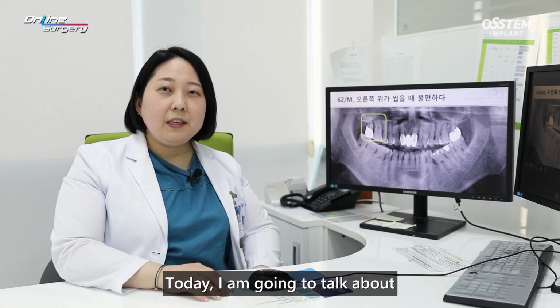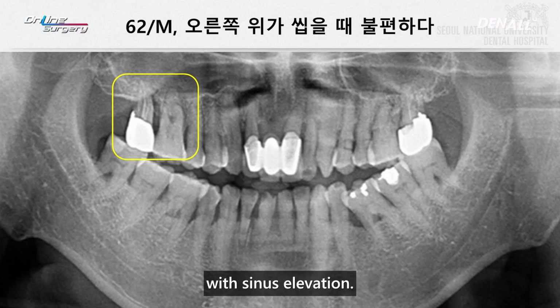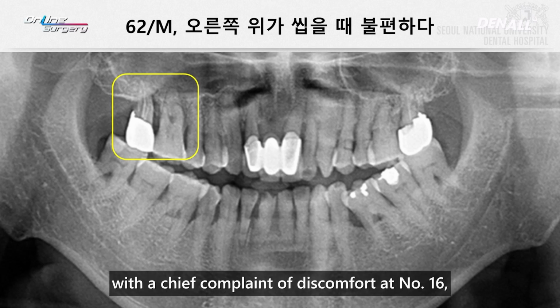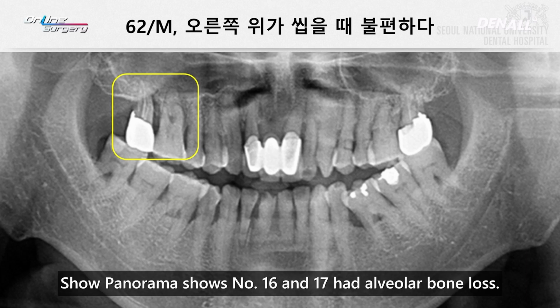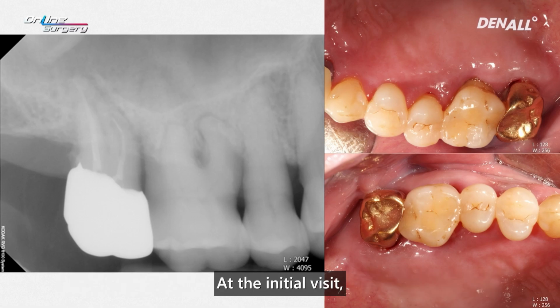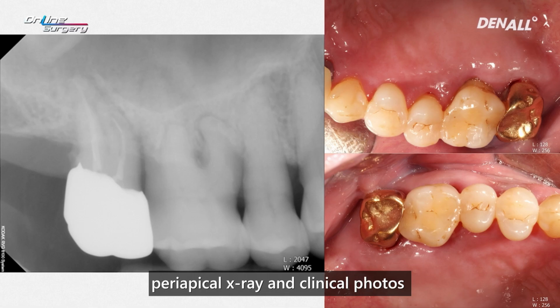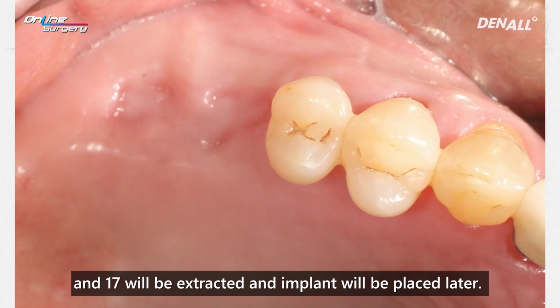Today, I'm going to talk about a case of maxillary posterior implant placement with sinus elevation. A 62-year-old male patient with the chief complaint of discomfort at number 16 and 17 at the upper right posterior region. Initial panorama shows number 16 and 17 had alveolar bone loss. At the initial visit, peri-apical X-ray and clinical photos. Due to the progressed bone loss, number 16 and 17 will be extracted and implant will be placed later.